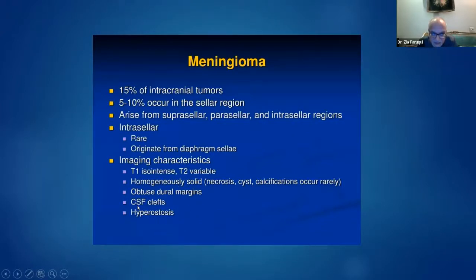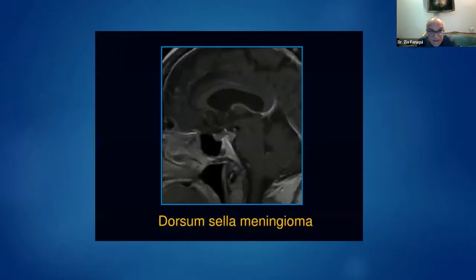And sometimes, again, this is typically reported in the literature, you can have hyperostosis of bone, but personally, I don't see a lot of it. I don't know, Kiran, do you see a lot of hyperostosis? Not really, sir. Yeah, I mean, I think I can remember maybe 3 or 4 cases where you had typical hyperostosis, including one which I was shown in my exam.